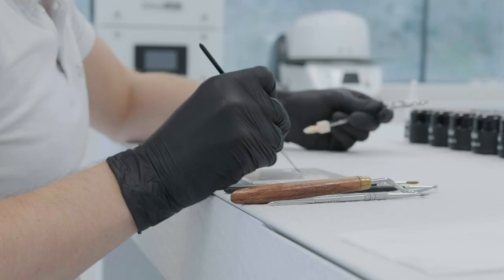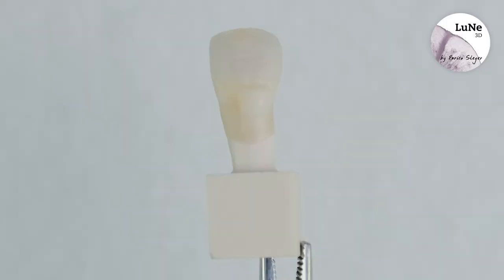The monolithic rooted tooth is characterized with ice stains 3D by Enrico Steger, and then fired with a glaze and stain firing.